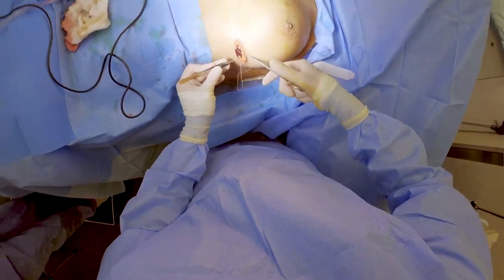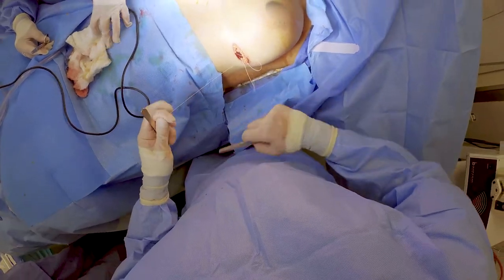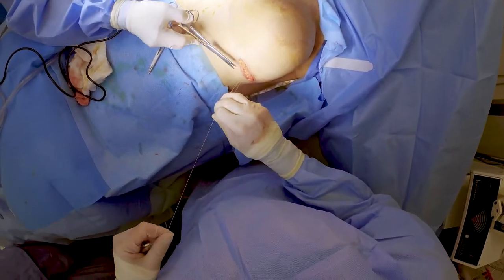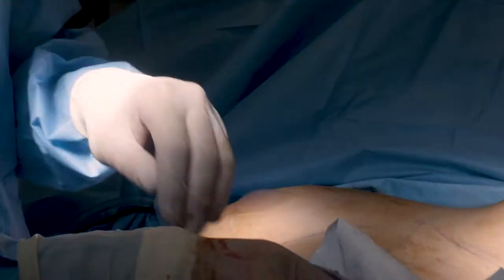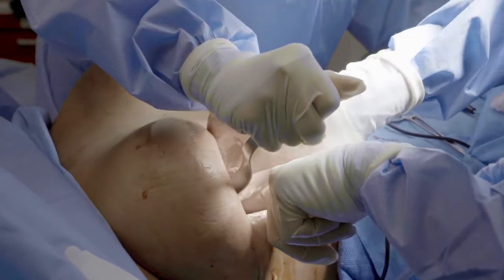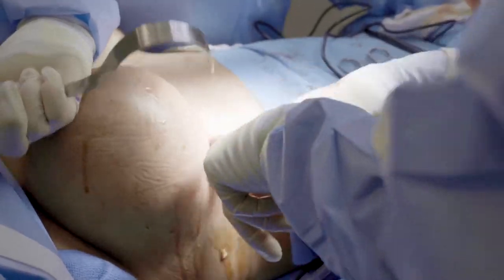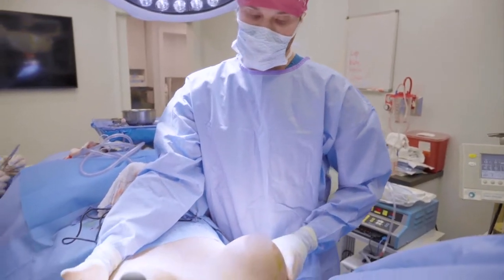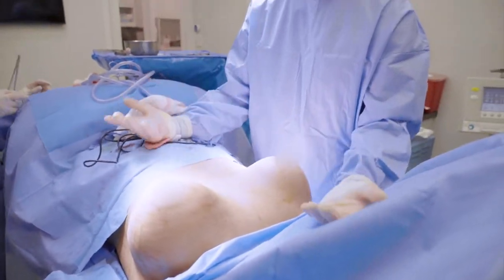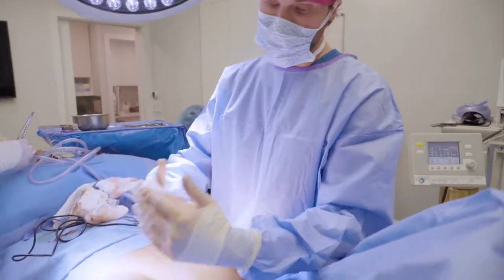I'm closing up the capsule around it just in case the skin breaks down for one reason or another — some people get back to activities a little too fast, so I have to make sure it's closed. These are just the same size implants. They look nice, good volume. There's a little bit of asymmetry, but this asymmetry was present before — we didn't try to change anything. Everybody's a little bit asymmetric; no two sides are the same.